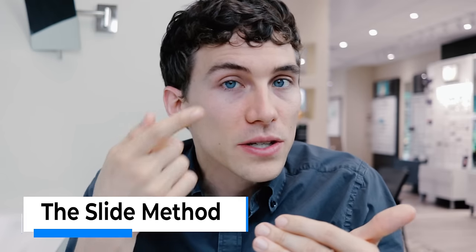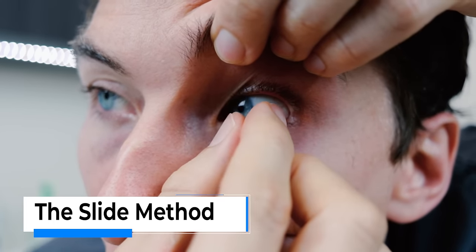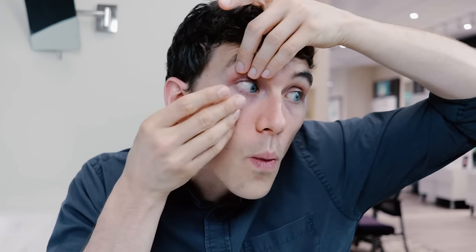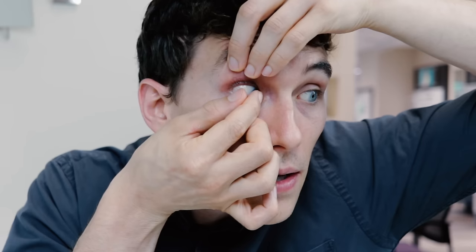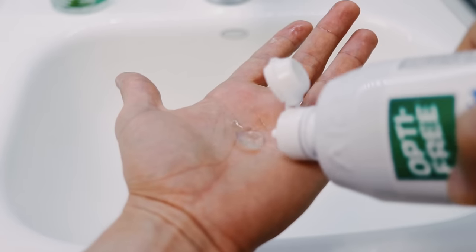The next method some people prefer mainly because they don't like actually seeing anything come toward their eye. The method is taking the contact lens and dragging it over to the white part of the eye — the sclera — and then still using the same little pinching motion to grab the contact lens and lift it off. Basically, you kind of look away from your fingers, drag the lens, and remove it. If your lens does fall out, you're just going to have to rinse it and clean it.